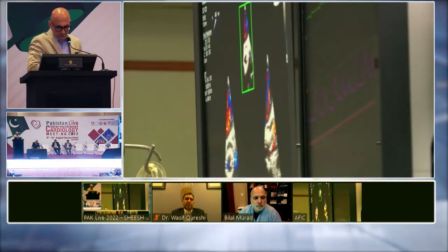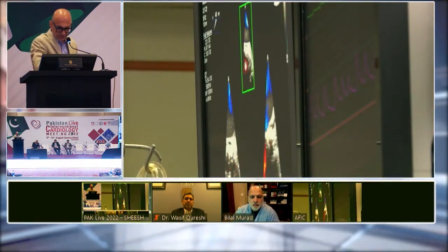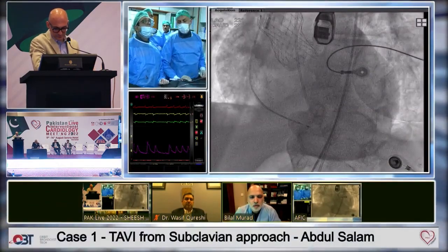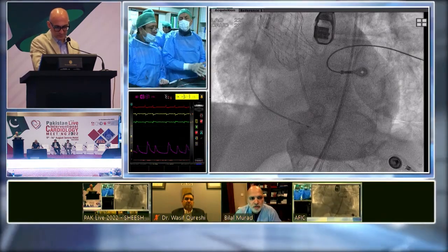Bilal, what do you think at this point? What would be your strategy for the PVL? Leave it alone, do some further dilation? I would leave it alone, given the amount of calcification using TAVI.